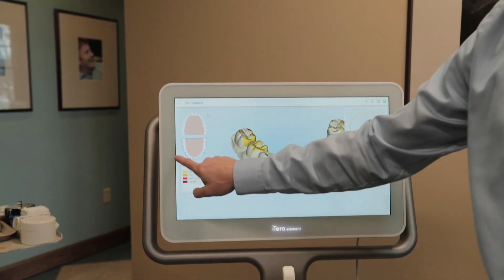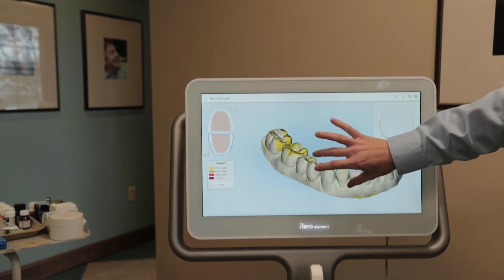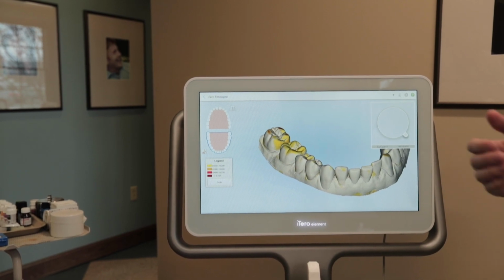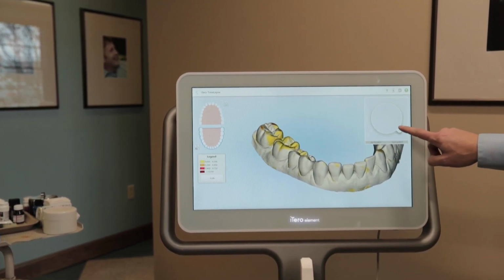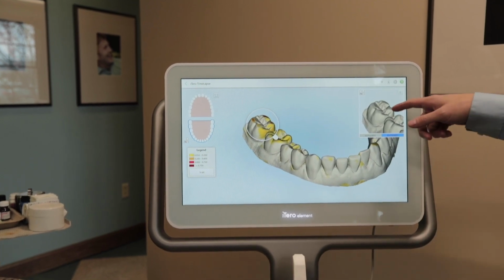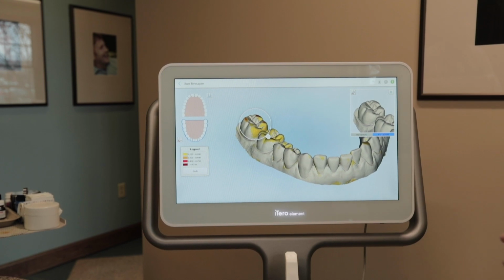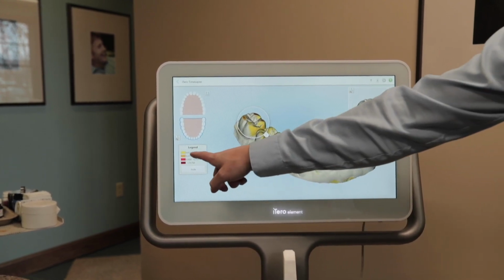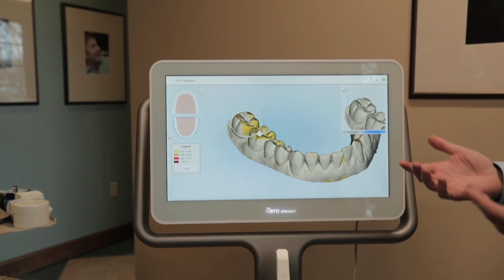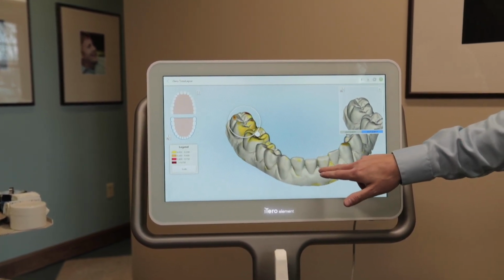Again, it is in color. It is also in stone. We like to use stone because you can see more surface texture. What we're going to show is where we have color, red being more severe, yellow being a little more mild. We're able to take this magnifying glass, move it over the posterior teeth, and show the patient how their cusp tips are wearing. And we can show them the wear over time. We can take this all the way down to 0.05 millimeters of wear, which is undeterminable by the human eye, but on the scanner we can show that and show the patient over time what's going on.